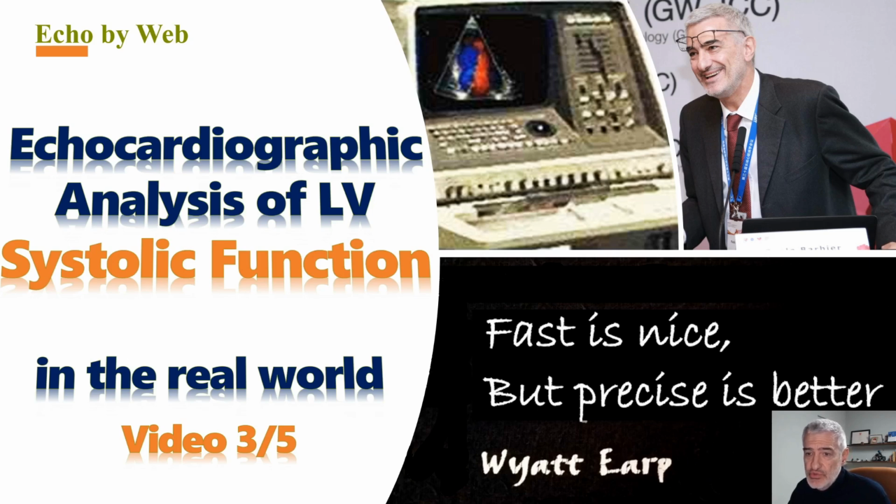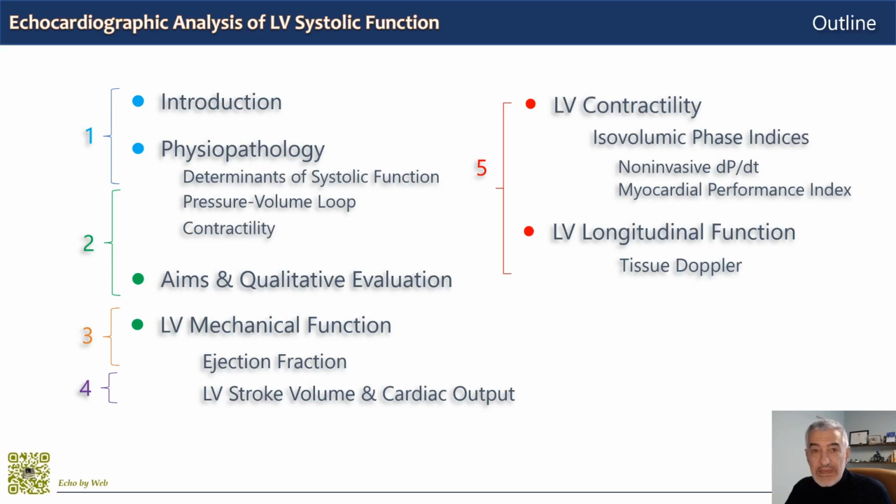Now, these talks assume that you have a basic understanding of how to perform pulse Doppler and continuous Doppler and of interrogation of intracardiac flow, how to perform tissue Doppler, and how to perform M-mode and 2D measurements. However, you will find on the associated website echobyweb.com that I mentioned before a large quantity of educational materials that address these topics. And this is the outline of this talk on left ventricular systolic function.